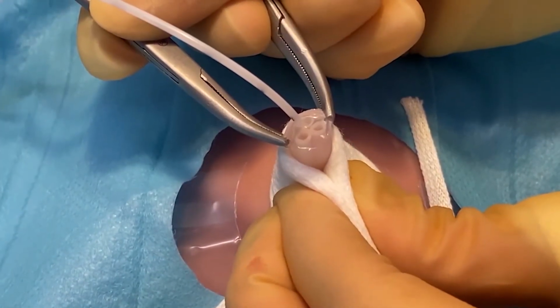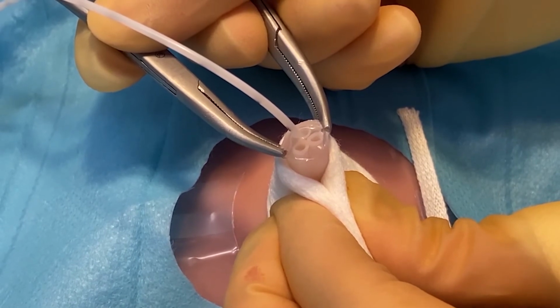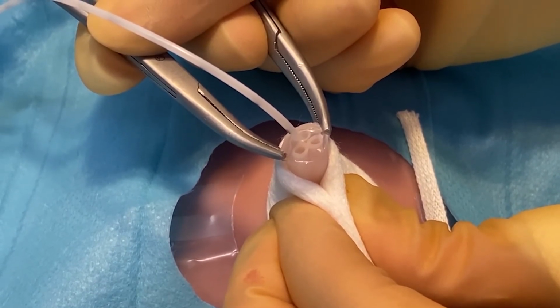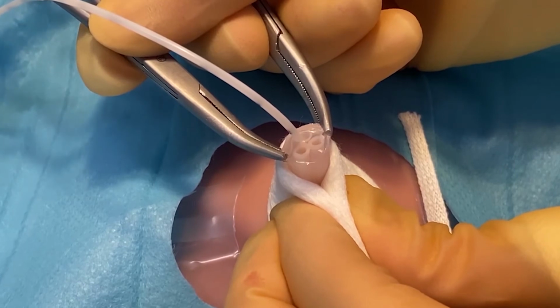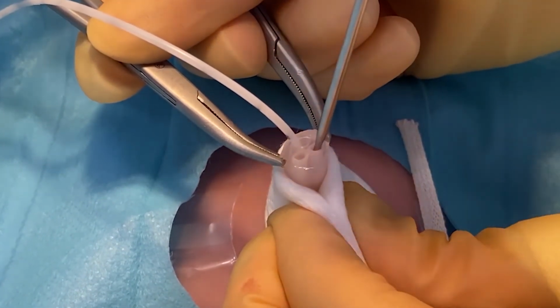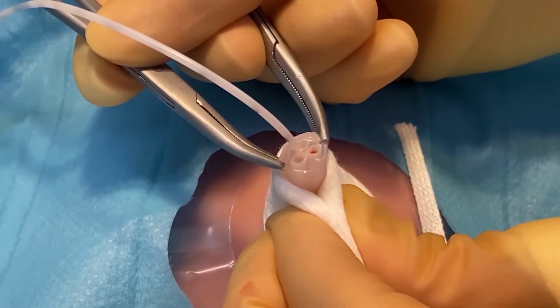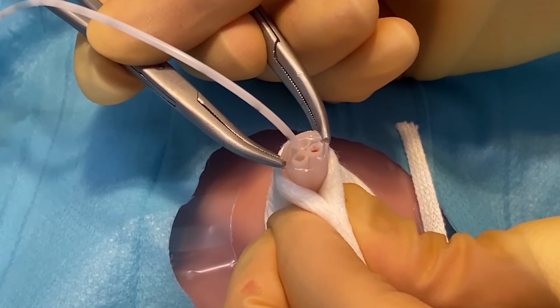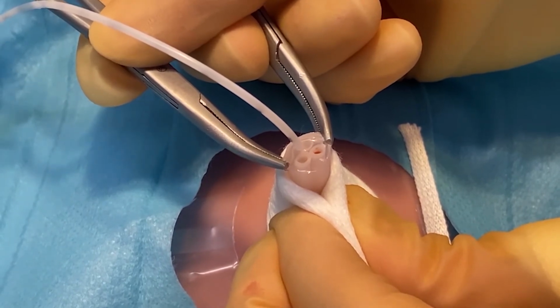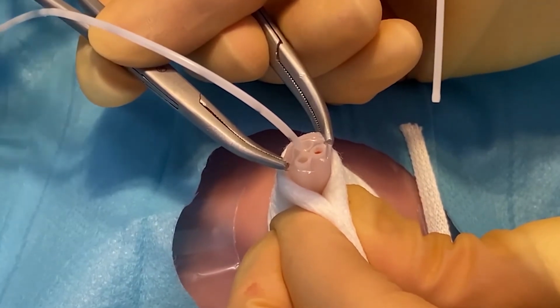So once I've flushed the UVC with normal saline, I'm going to go on to insert my UAC. So it's a very similar technique. You locate your artery, gently dilate with the dilator, and then with your primed UAC, I'm going to insert that in the vessels.